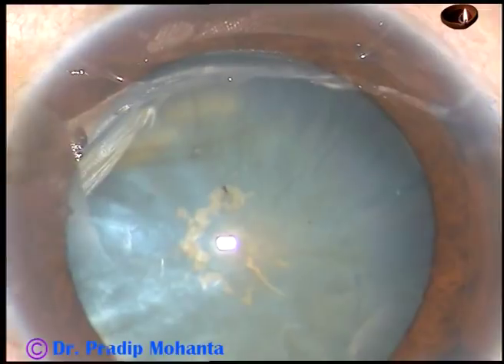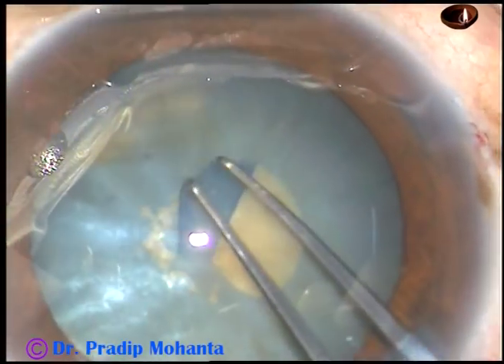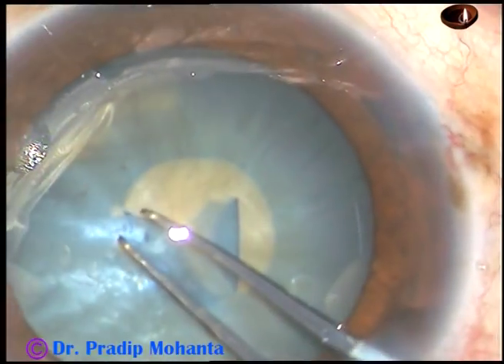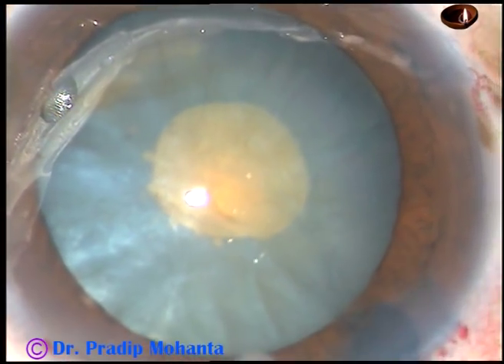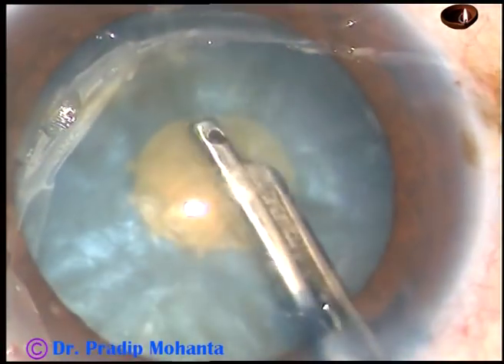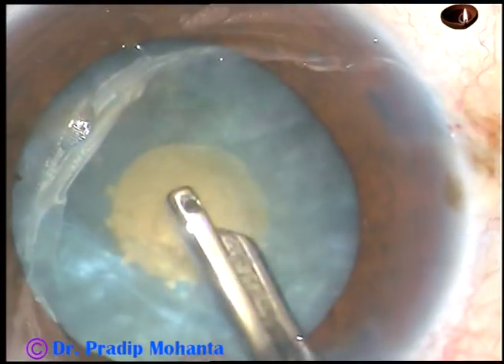My plan is to do a small rhexis first. There is no leakage of any fluid, but there is a lot of convexity of the anterior capsule. Here I am aspirating some cortex to reduce the convexity of the anterior capsule.